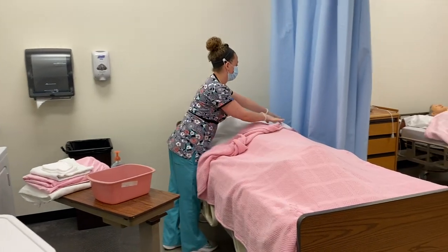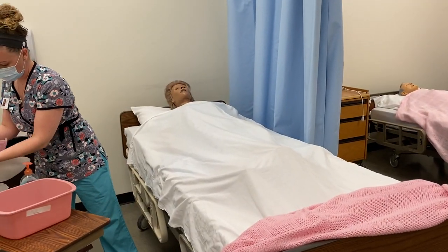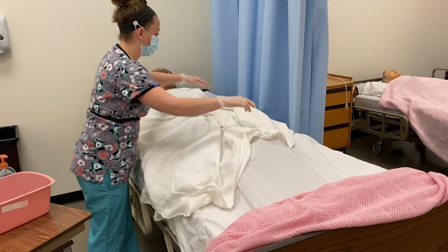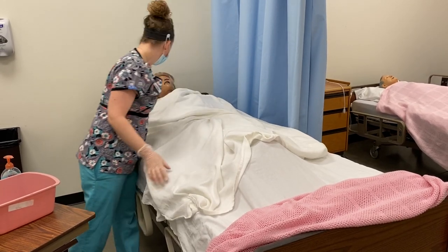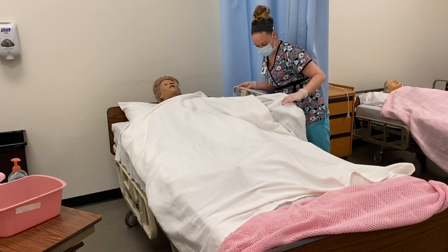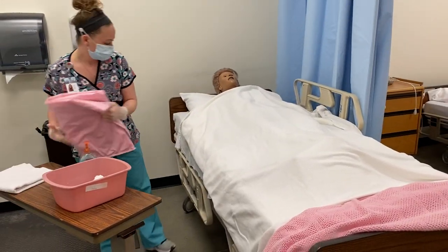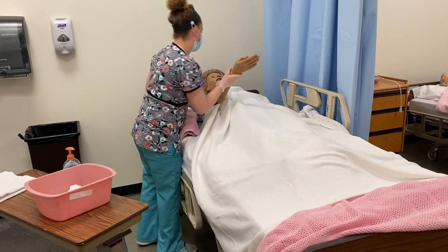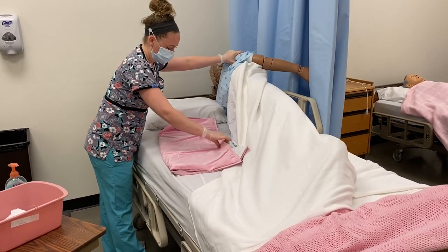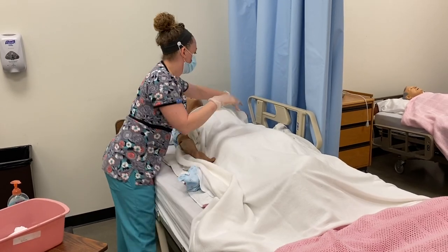I'm going to pull back your comforter and cover you with your bath blanket. I'm going to raise my side rail up before I roll you on your side. I'm going to have you roll over on your side and tuck my cloth pad under you.